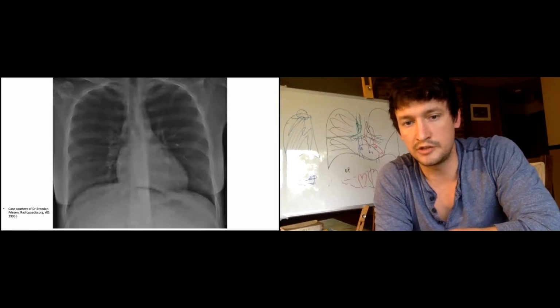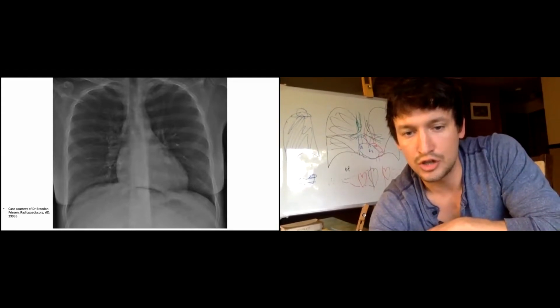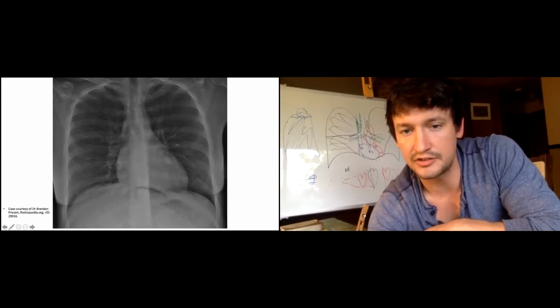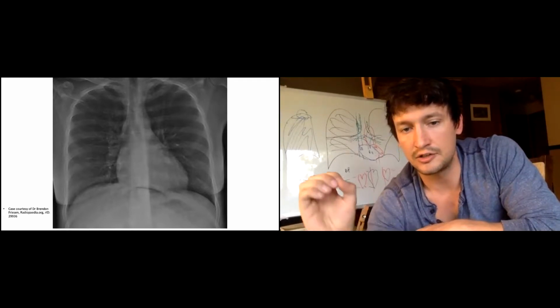Okay, would someone like to tell me what they see on this radiograph? Air, under the heart. I believe he meant under, but we were speaking a little German, so that's appropriate. Yes, there is air outlining the heart. And this is a sign that you want to look for, pneumomediastinum. You can also see air under the heart.